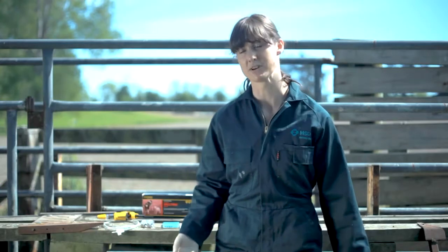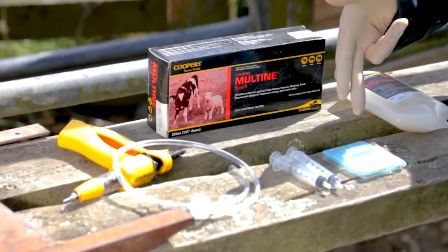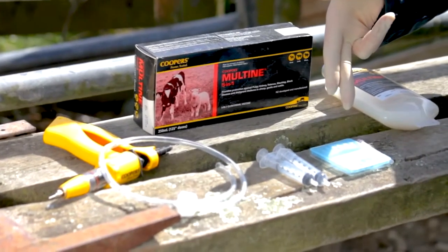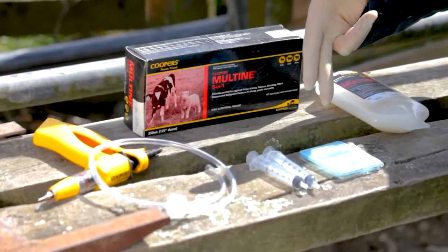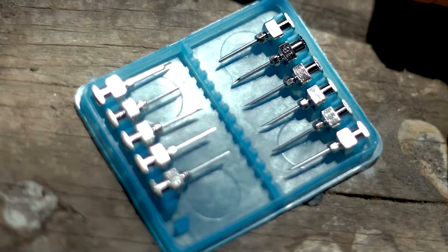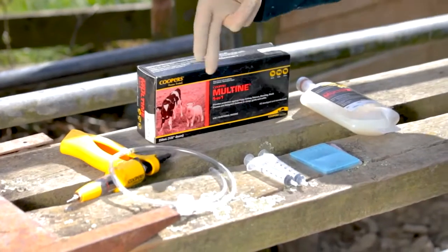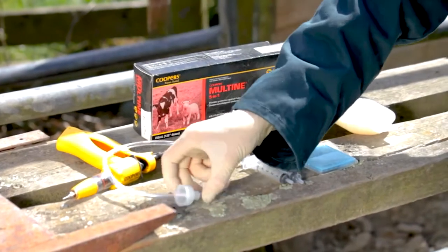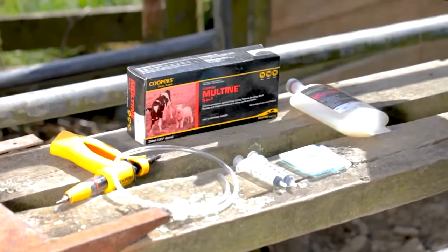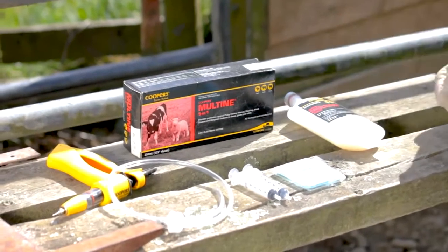This is the equipment required. Needles allow penetration of the skin into the muscle for IM injection or into the space between the skin and underlying tissues for sub-Q injection. Use 18 gauge short vaccinating needles. A syringe or vaccinator gun is used to deliver the correct dose of vaccine into the animal. The draw-off tube connects the vaccinator gun to the VaxiPack and the vaccine.